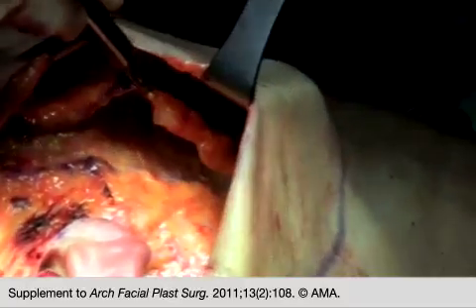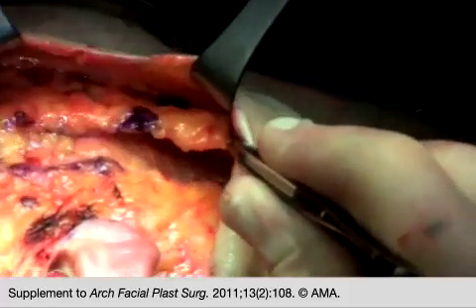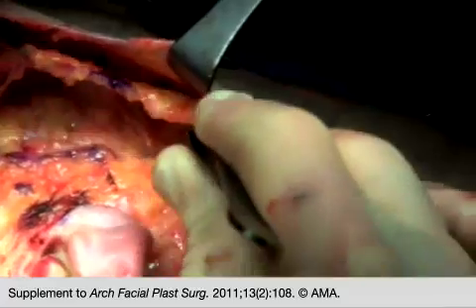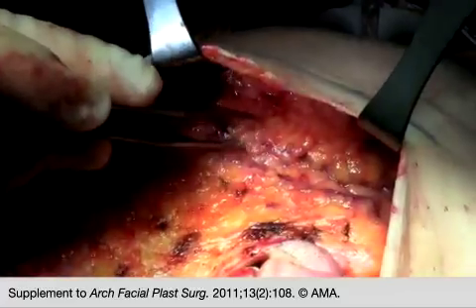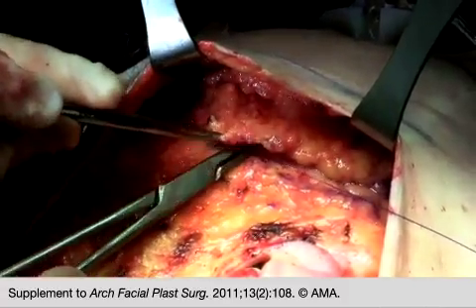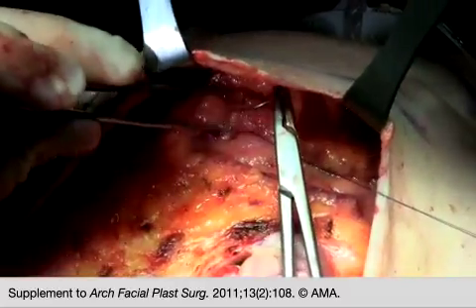The fusion of the SMAS with the fascia of the sternocleidomastoid muscle is detached for 5 to 6 centimeters inferior to the mandibular angle. The SMAS flap is advanced superiorly and laterally and sutured to the posterior incision line of the incised SMAS.